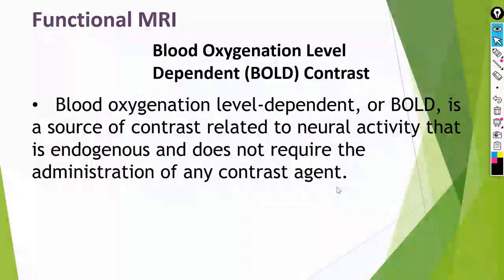For instance, if I touch something hot, that heat sends a signal to my brain at a specific location, responsible for my hand's movement to pull it away from the fire. So, in that area, there was a high blood supply. When the blood supply increases in this area, it delivers oxygenated blood at a higher ratio than deoxygenated blood.